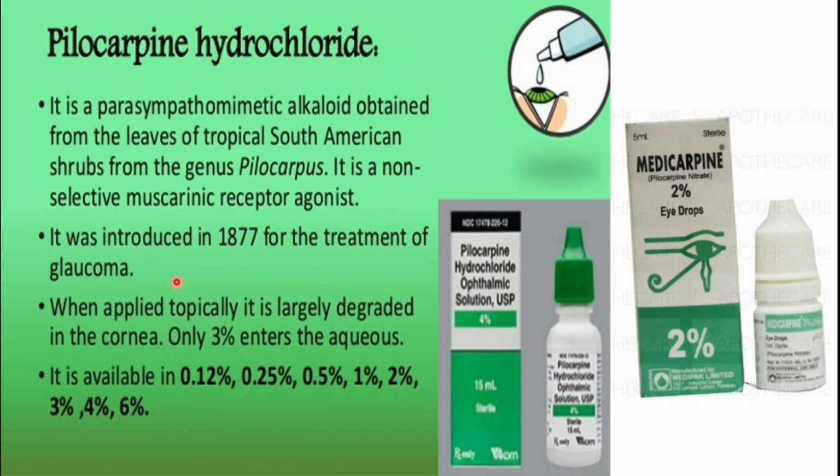And I've told you earlier what effect pilocarpine will produce on the pupil. Pilocarpine will cause contraction of the pupillary sphincter muscles, which will decrease the size of the pupil and cause miosis. So upon instillation of pilocarpine into the rabbit eye, miosis will occur. There will be a decrease in the size of the pupil, and that will occur because of the pilocarpine administration.